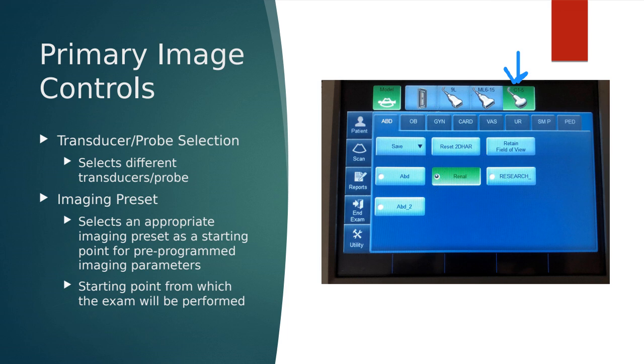It's going to give us standard measurement options. It's going to give us kind of standard grayscale field of view of our picture. So we start from there, and then we can manipulate further as we start scanning our unique patient. So we have our transducer selected and highlighted. We see all of these different tabs popping up underneath it on the touch screen. These are all different folders of presets that are going to be populated with that active curve transducer.